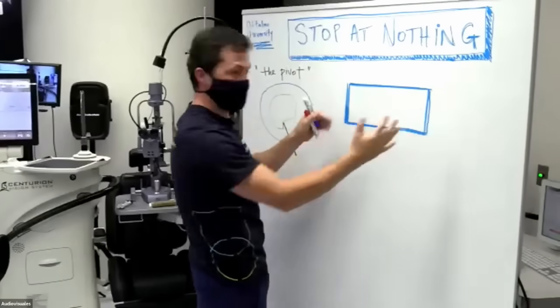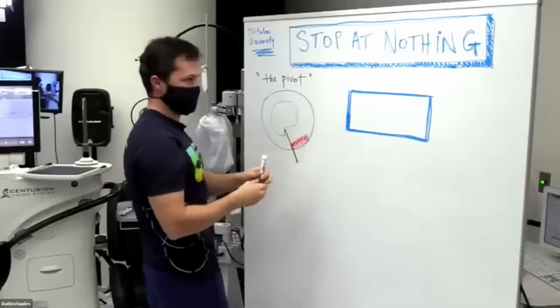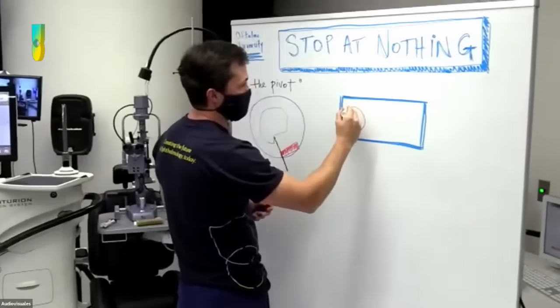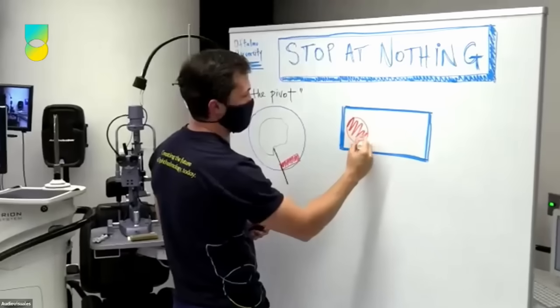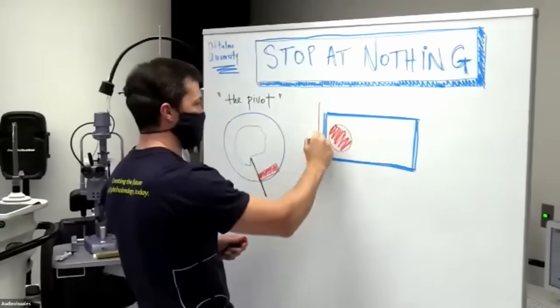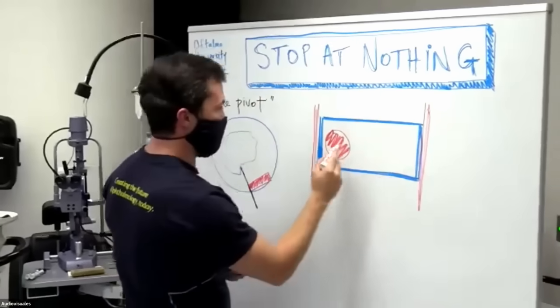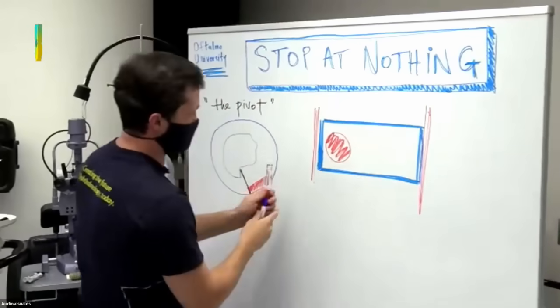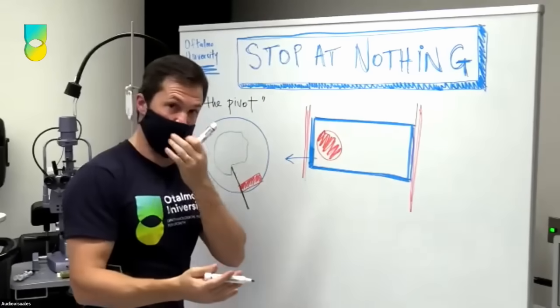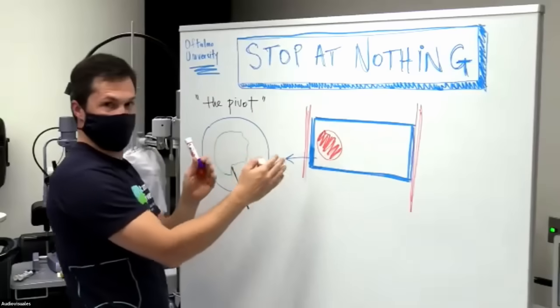Okay. The first thing is about what we were talking. Imagine that this is the incision itself. It's not like this, but when you have an instrument, when you have the forceps, one of the most important things to learn, and it's not easy to learn, is that the forceps has a limit, and the limit is the incision. If that forceps goes out, what's going to happen? The eye is going to move. The eye moves if the forceps pushes the incision.